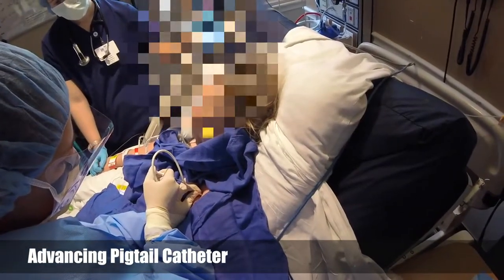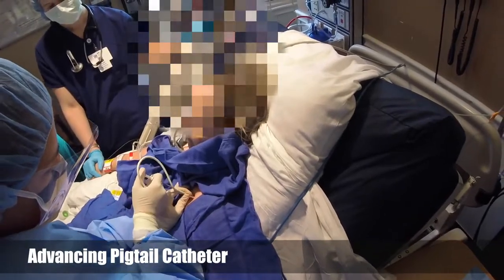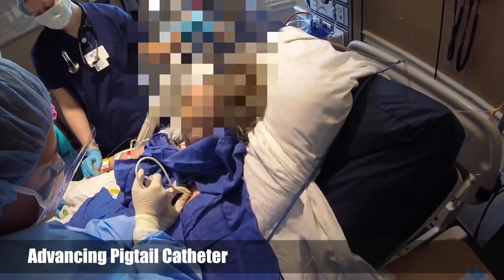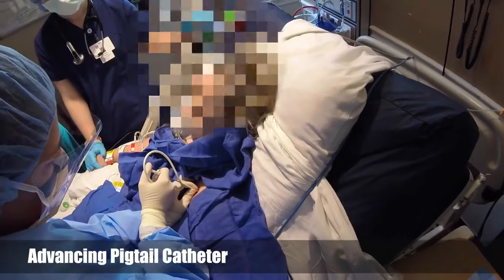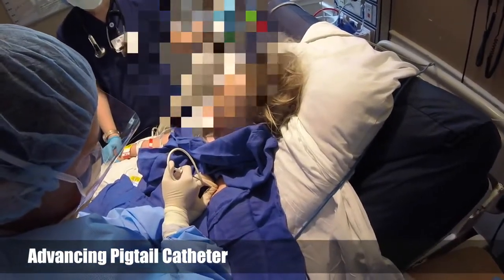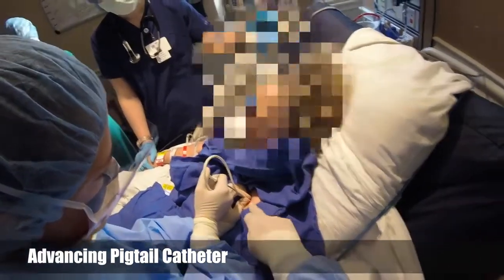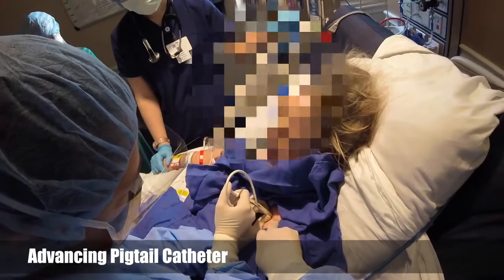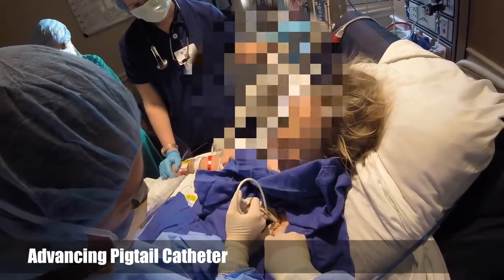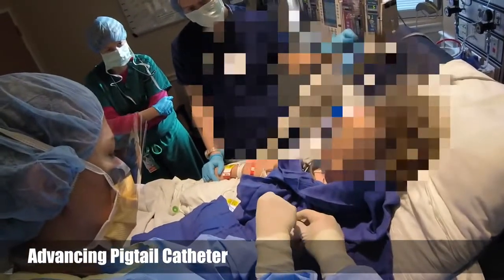We can use a little bit of 1% lidocaine to moisten the catheter a little bit more if you're meeting resistance with the blunt dissection through the subcutaneous tissue. Again, the right thumb is driving the needle and the overlying catheter in through the subcutaneous tissue until you get to the appropriate depth of insertion.